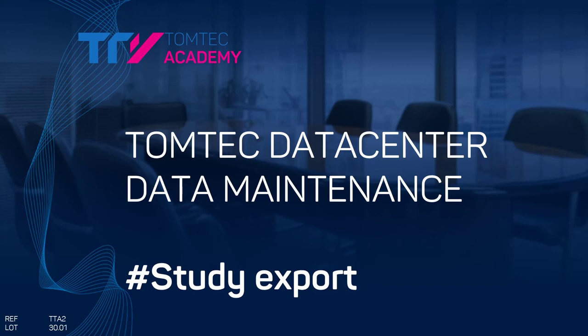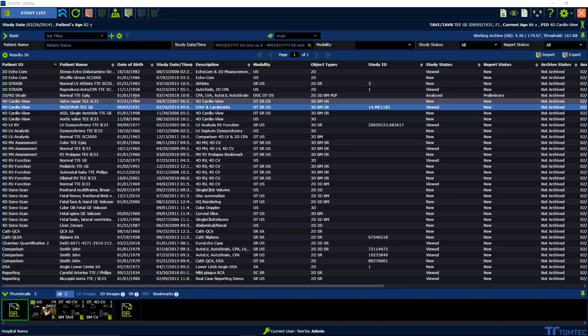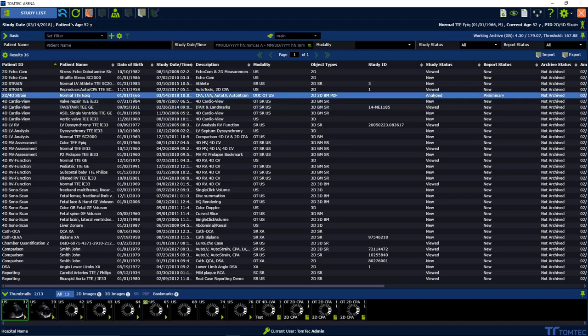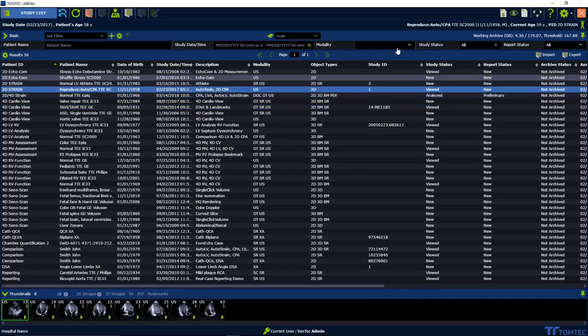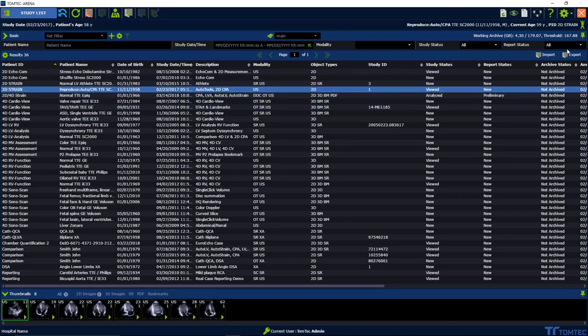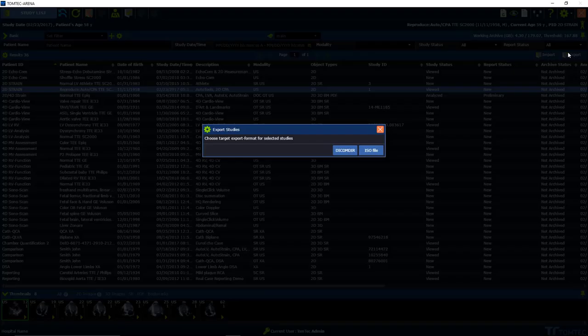How to export studies in TomTech Data Center. Select a study you want to export, then click the Export button next to Import and choose the dialog for your action.